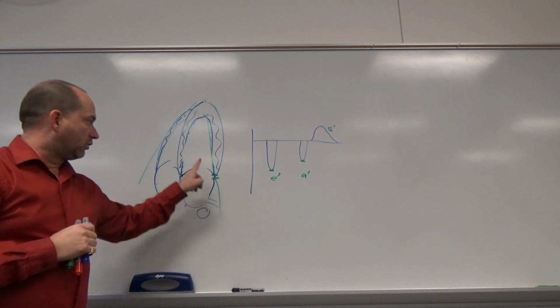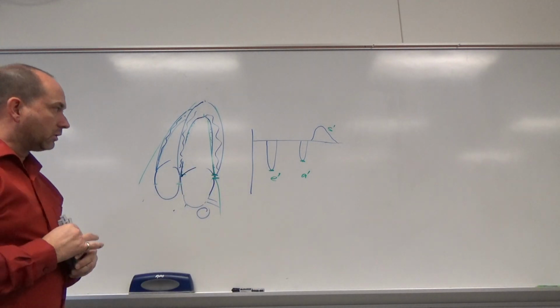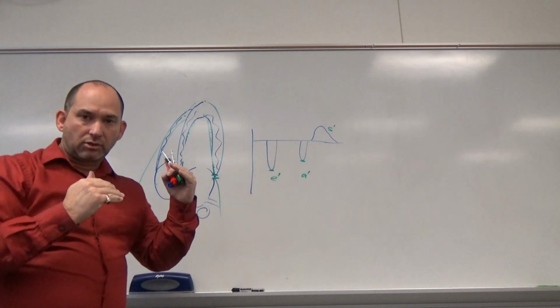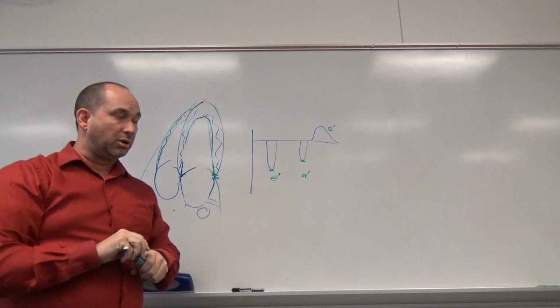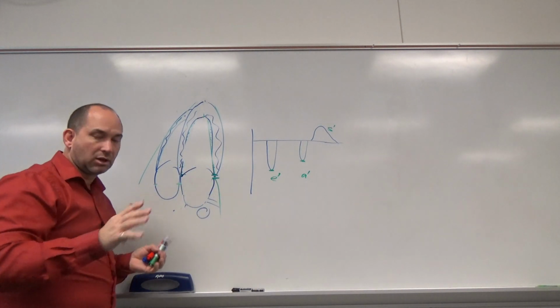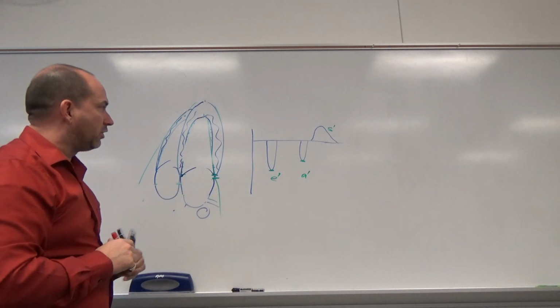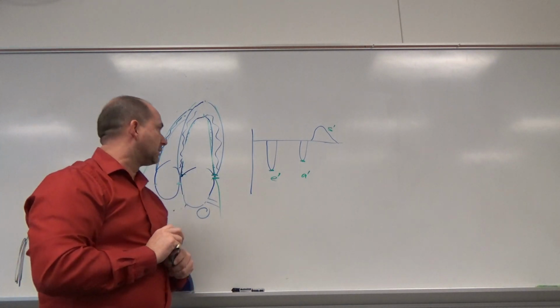We compare this to the mitral inflow that we saw earlier. We're also comparing the size of the E and the A waves to see that the E wave should be bigger, but it's not always. And if it's not, we'll get into that with diastole. So that is tissue Doppler, so we will have you do that.